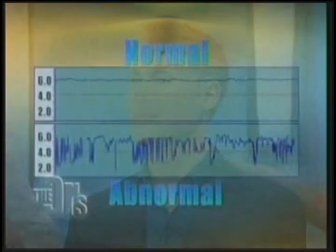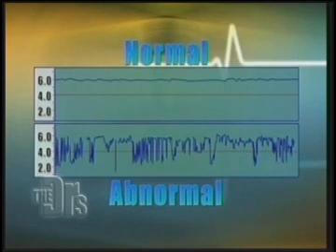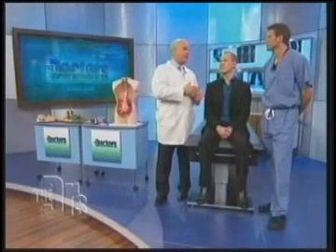So this was in his esophagus. What were his results like? The first graph on top is what a normal pH monitor is. So you see that it doesn't vary very much. The bottom one has all those spikes. I've never seen this many spikes. Jacob in 48 hours had 172 bouts of reflux. I mean, significant reflux. And what was odd about it is that he had the majority of them while he was standing up. Most people have it while they're lying down. So he really has a big issue.